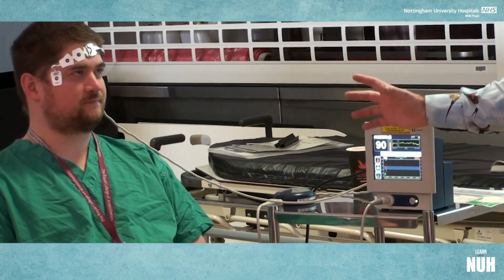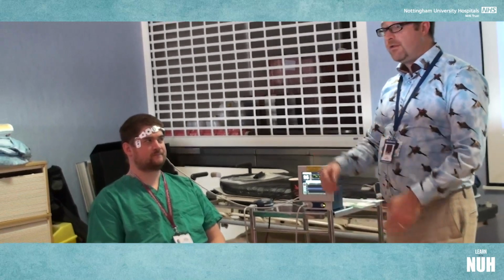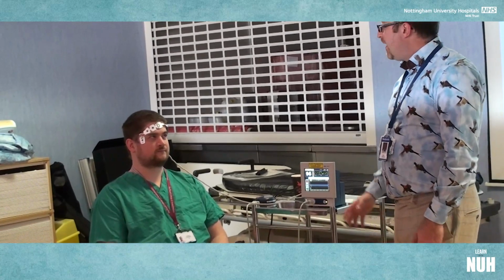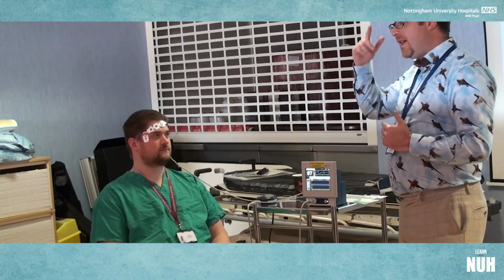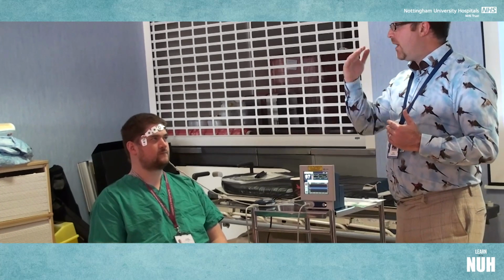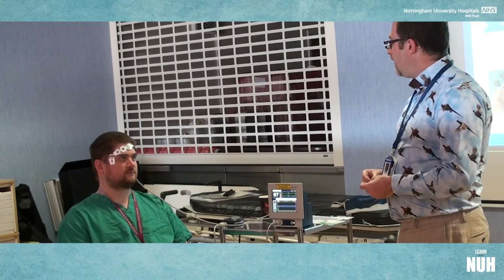Bear in mind, you might fall asleep at about 80. Deep sleep, 75, you're in the light to moderate sedation range. So it's just an interesting example of this corresponding link with cerebral metabolism, where if you take away cortical activity from the senses, cerebral metabolism drops, the brain's very efficient, and it shuts down slightly, so your BIS will drop slightly. So when you're sat in the coffee room, you've got your eyes shut and you're relaxing, you're probably not far off the natural sleep range, maybe.